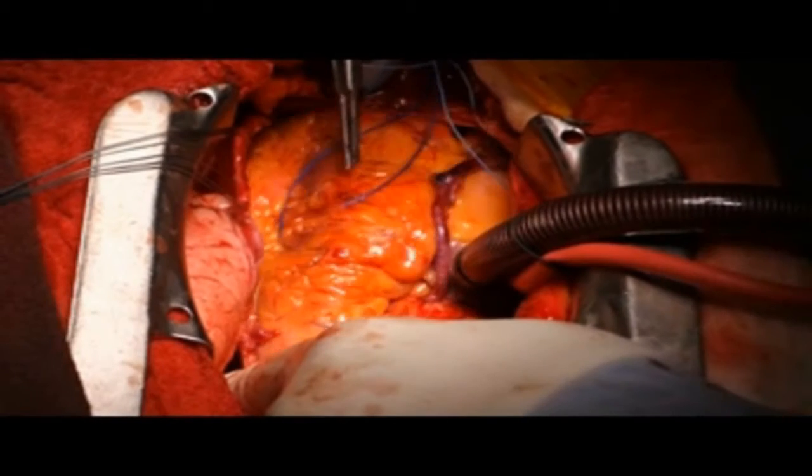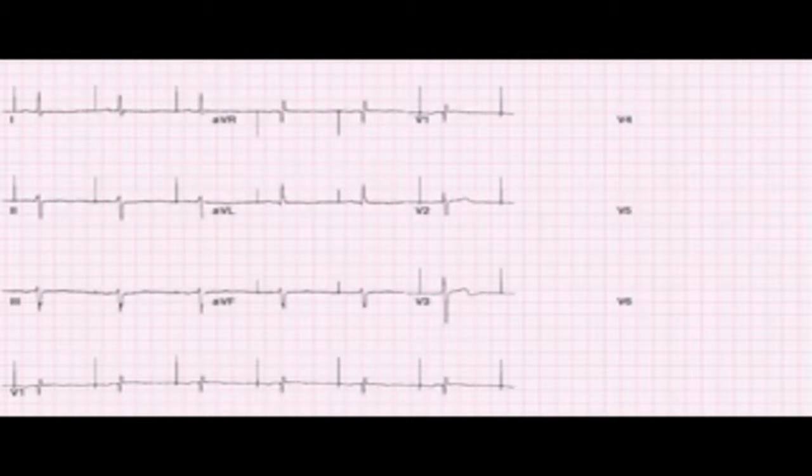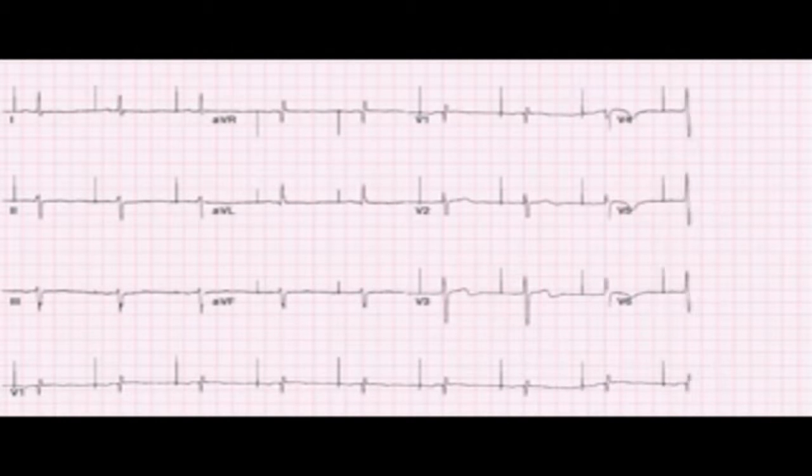For patients with a pacemaker, you may need to select settings specific to the pacemaker to decrease the possibility of counting pacemaker artifacts as QRS complexes.